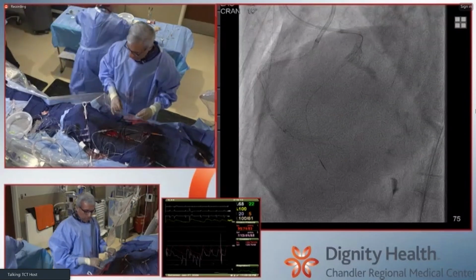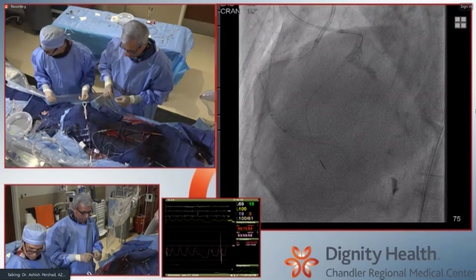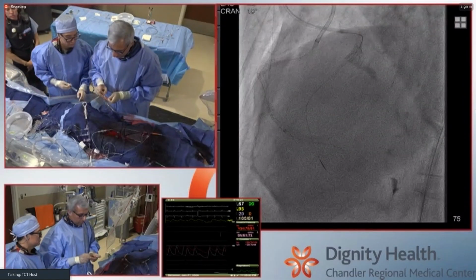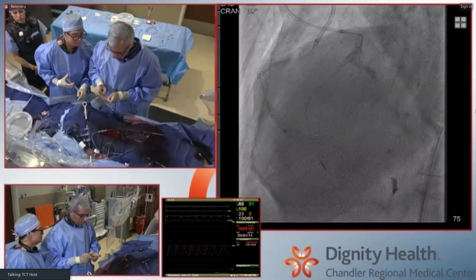Your pressure's back to very much normal now. Yeah, exactly. I don't know what it was. Me neither. Probably you're right. Something to do with the guide or something, because I mean, what else reverses that quickly? Maybe sedation, if you got a bunch of sedation just prior. Yeah, maybe.